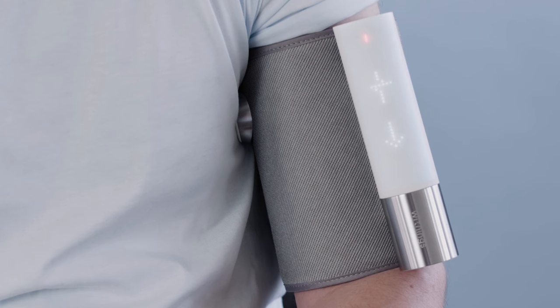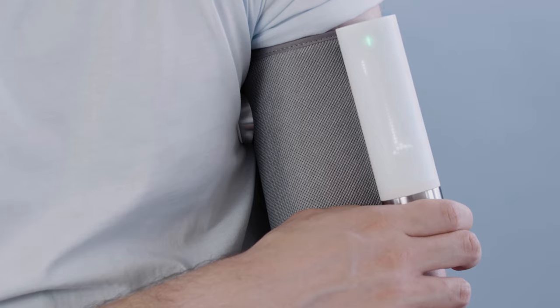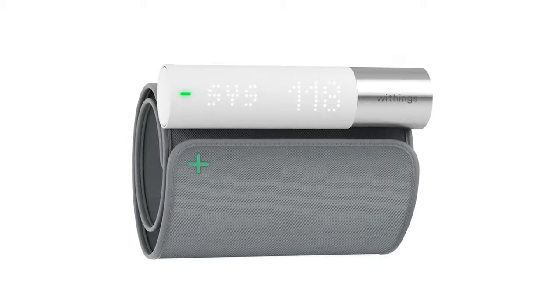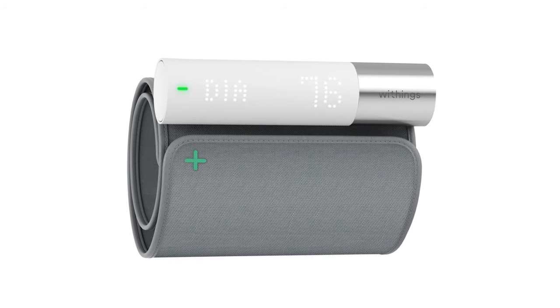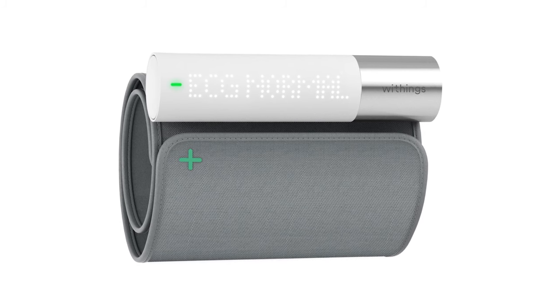When the device shows an ECG pictogram, place your right hand on the metal tube and make sure the stethoscope is against your chest. At the end, your systolic, diastolic, and heart rate readings and AFib detection results will be displayed on the device.